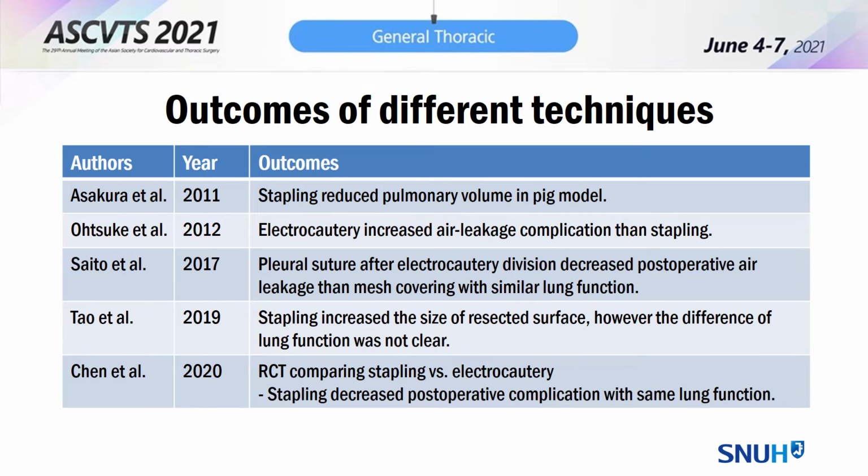For parenchymal division, there are many different types of methods. Each surgeon has their own technique, so hundreds of thousands of different ways of controlling the parenchyma exist in the world. However, I chose just 5 papers which are representative and have some meaning in understanding this issue.